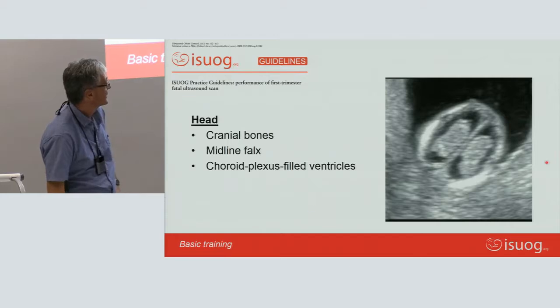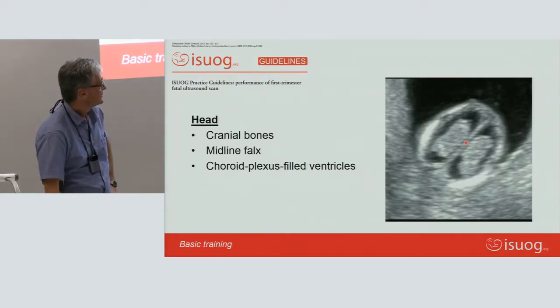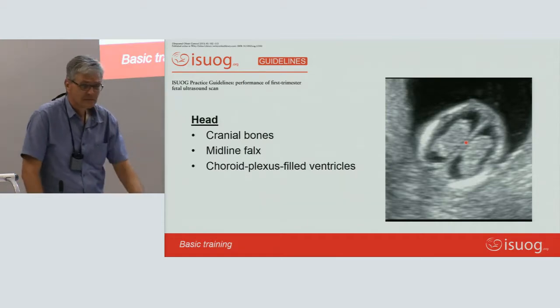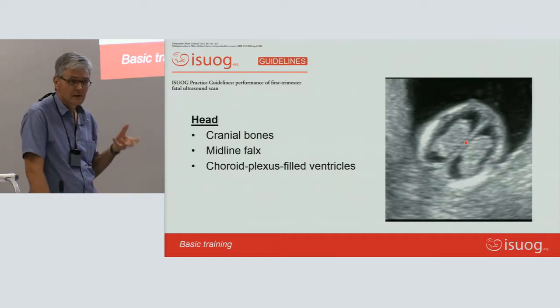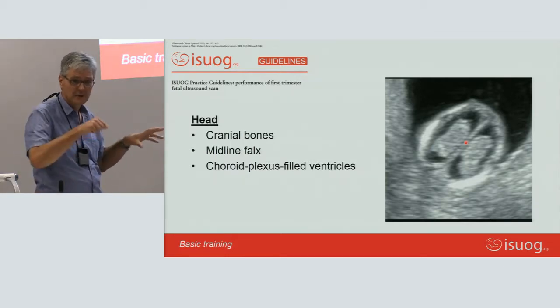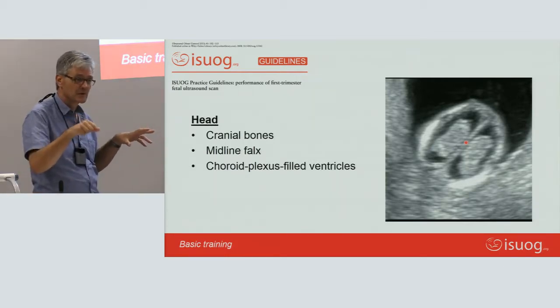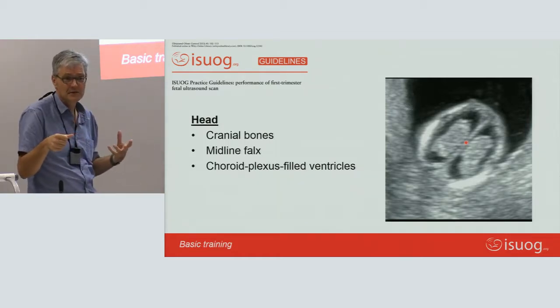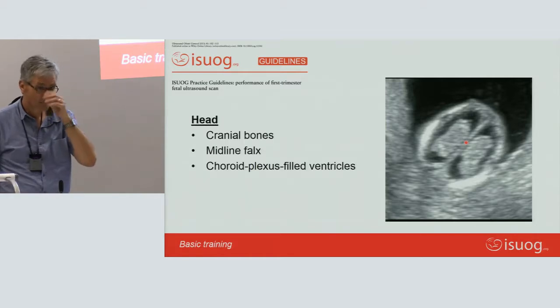Yes, good. Right, so there's the red marker on the falx. As experience grows, you'll start knowing that, I've tried my tricks, and if in the past 10 babies or 100 babies or 1,000 babies I managed to see this, and now I don't see it, in other words, it's the baby's fault.